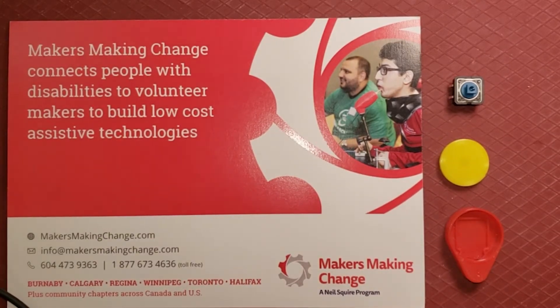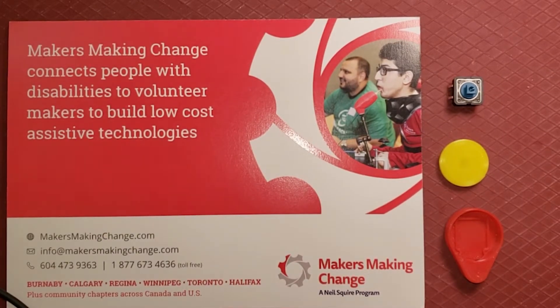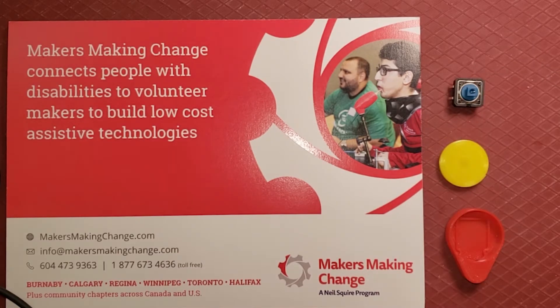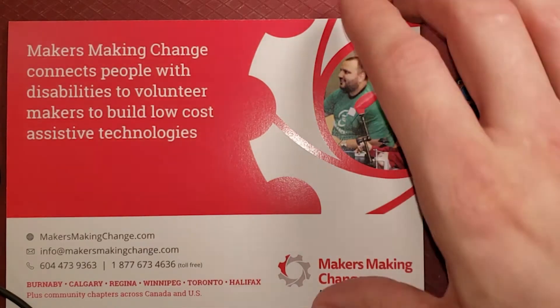Hello, this is Chad Lehman. This is a quick video to show you how to build our RainDraw Switch. The RainDraw Switch is a project of Makers Making Change, which has a library of open-source assistive technology that you can build yourself. You can find more about this device, including the instructions to 3D print it, where to buy the components, and all the assembly instructions right on our website, makersmakingchange.com. Search for the RainDraw Switch in our assisted device library.